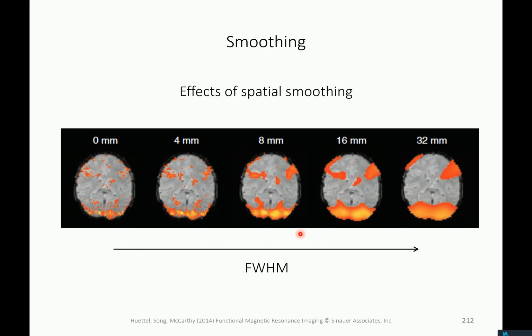If you use a broad full width half maximum, so your filter looks something like this, then the data that you put here has quite a contribution from this, so it gets smoother. So this has an influence on what you will plot here. Now, this is the first thing, and then you shift the filter window here and do the same thing. That's how filtering works.